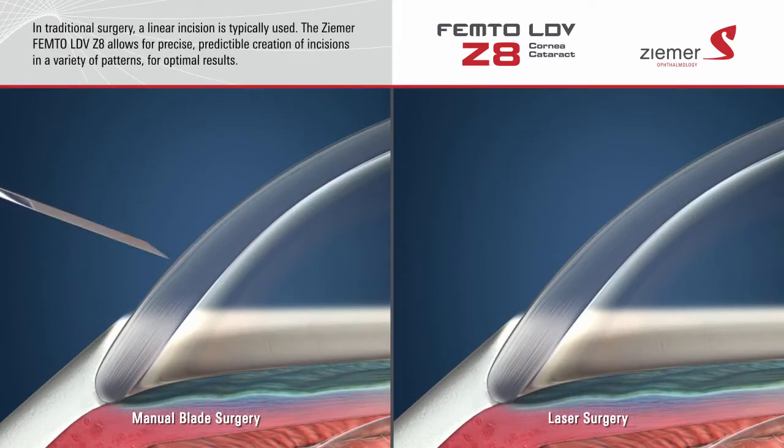When performing cataract surgery with a blade, a linear incision is typically created. The Zeemer Z8 laser allows for the predictable creation of incisions in a variety of patterns for optimal results. Incisions made with the Zeemer Z8 laser typically heal on their own, without the need for sutures.